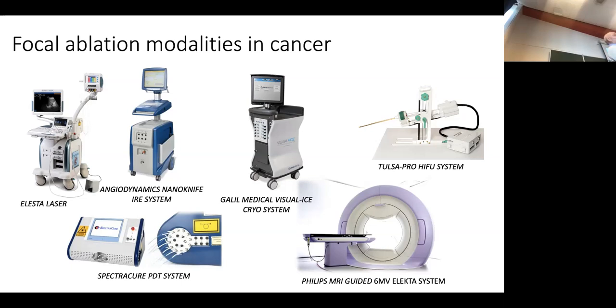With the needles there, you can start freezing the tumor and make it ice cold and cells die. Or you can heat it and burn it away. We have lasers to burn it away. That's an indirect, what we call hyperthermal shock to the tumor. There are a whole range of things we can do with tools like that, which is quite nice, minimally invasive. For example, if we do a laser treatment, you can be done in 10 minutes. Amazing.